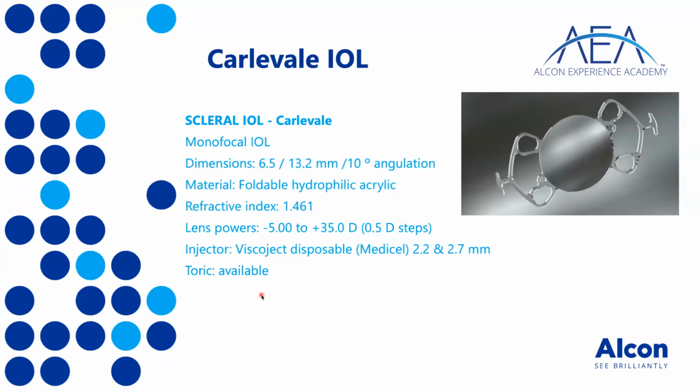So what was Carlo's thinking? His thinking was exactly like mine. Scleral fixated IOLs do work very well, but they are incredibly fiddly and they take an awful amount of time. Fair enough. So let's understand why it takes time. It takes time because it's difficult to insert the haptic inside the needle, and it's difficult to work with two hands on two sides and make sure that the pushing and pulling that you do on the lens is good enough but not strong enough to snap the haptics.